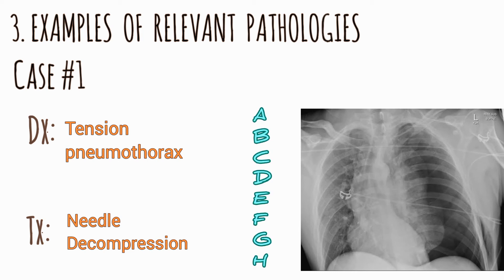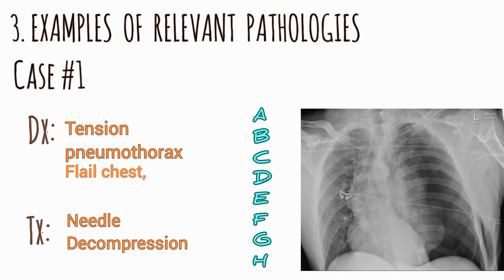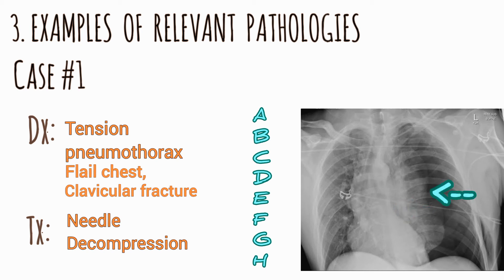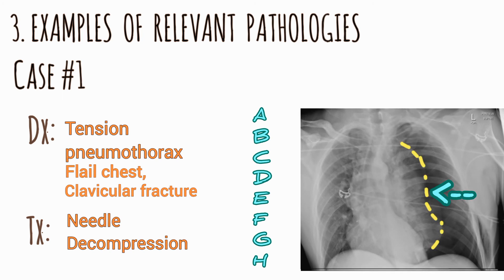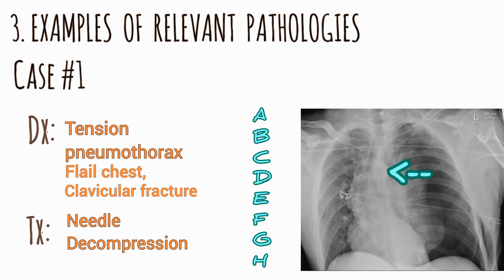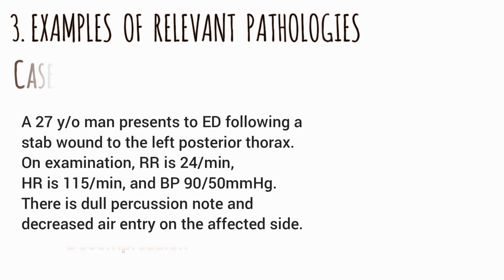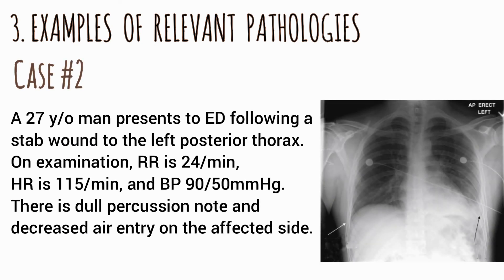On the radiograph: the trachea is shifted to the right; there are fractures of the 3rd, 4th, and 5th ribs posteriorly and a fracture of the middle third of the left clavicle; the heart is shifted to the right; the diaphragm looks normal; no effusion is seen; the left lung looks collapsed; the aorta is also shifted to the right; the gastric bubble is not visible; and the hila cannot be located.